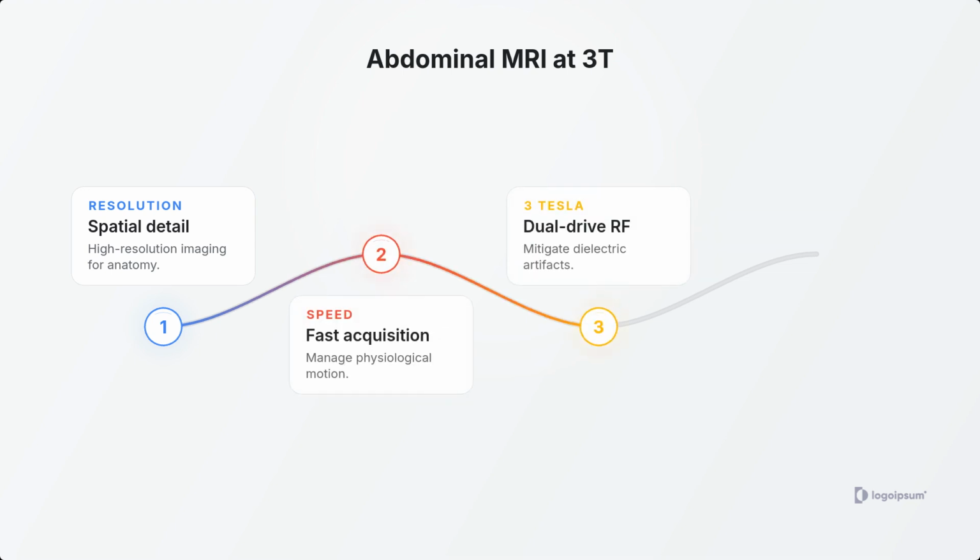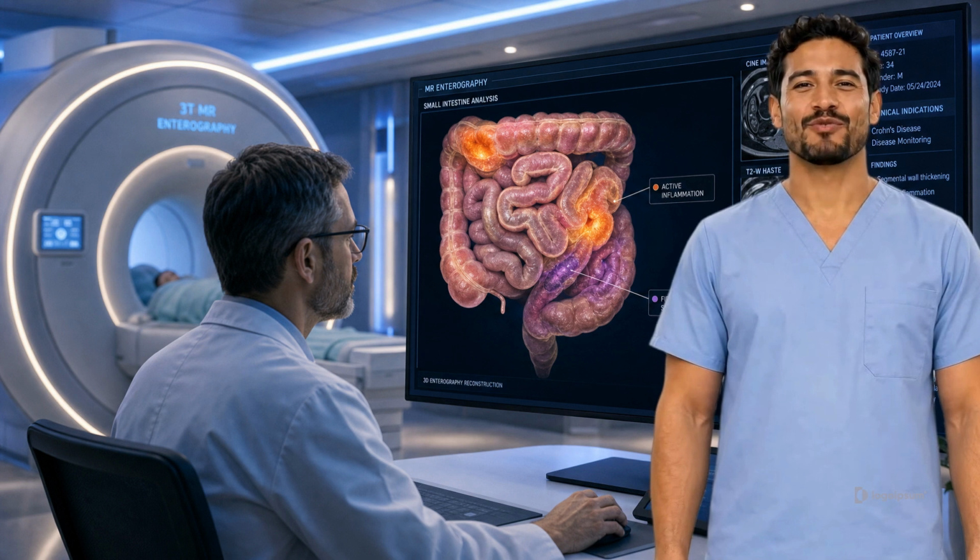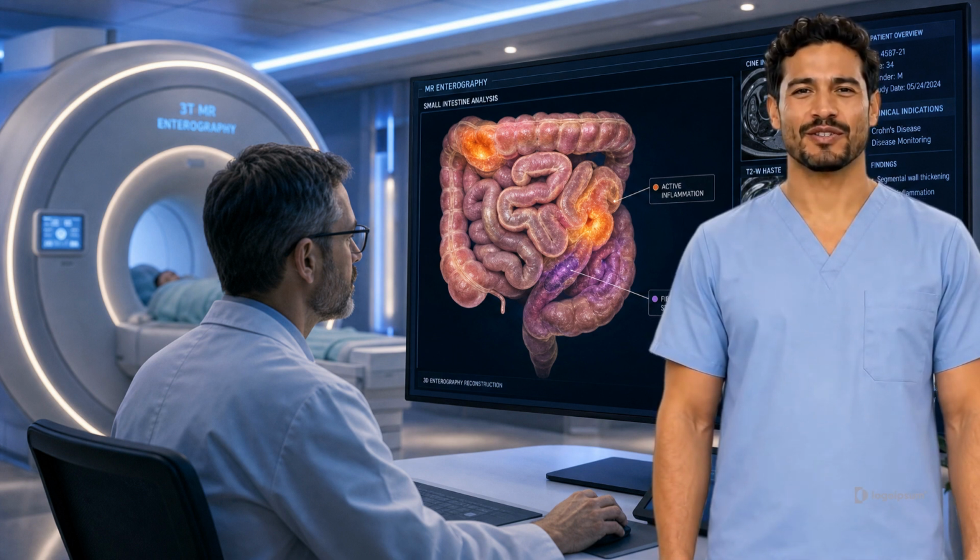At 3 Tesla, technologists must mitigate standing wave dielectric artifacts by utilizing dual-drive RF transmit technology. Applying Dixon fat saturation techniques ensures uniform background fat suppression across large abdominal fields of view, preserving signal contrast in deep pelvic bowel loops. MR enterography fundamentally changes clinical decision-making for gastroenterologists.